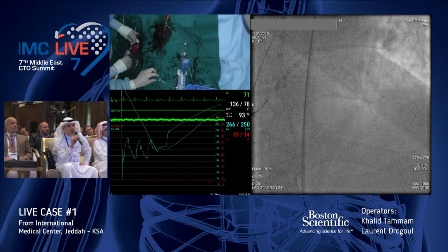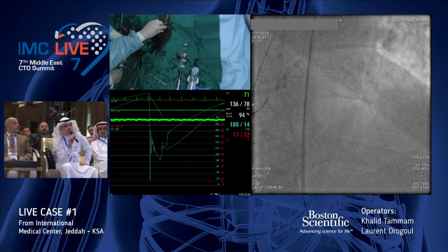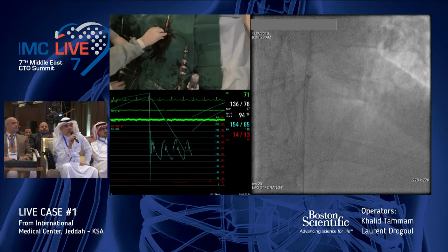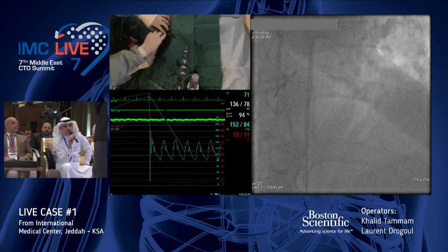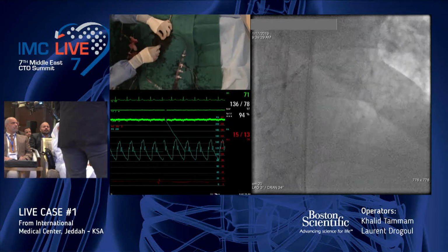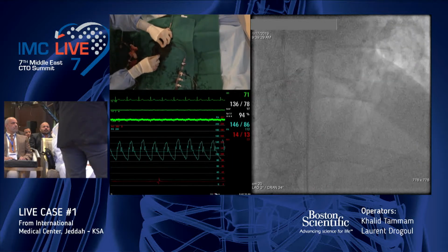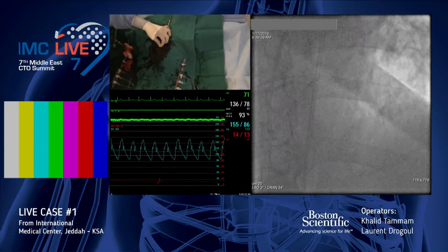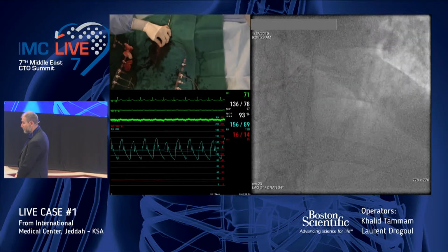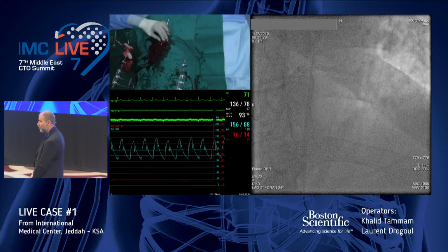Can I ask a question? Yes. Alex? Why not switching to a rotor wire and doing a rotoablation? This case is going so well, touch wood. Good. So why not, the proximal part is a large vessel. Why don't we rotoablate, so we really make proper preparation for the stent? Yes. So I think I will answer this question after checking the IVUS. So we check IVUS now.